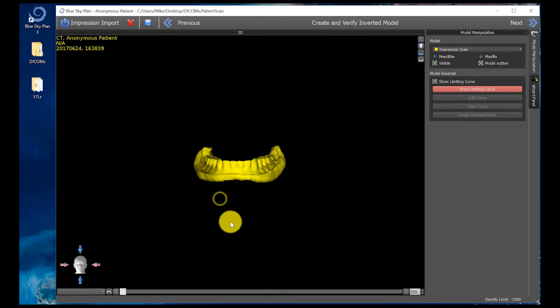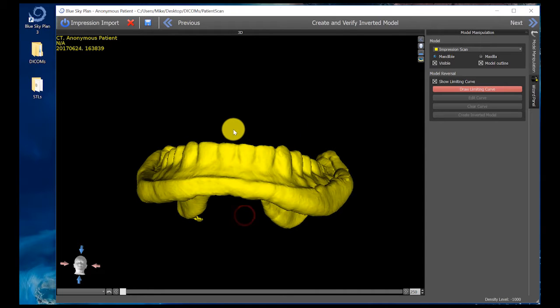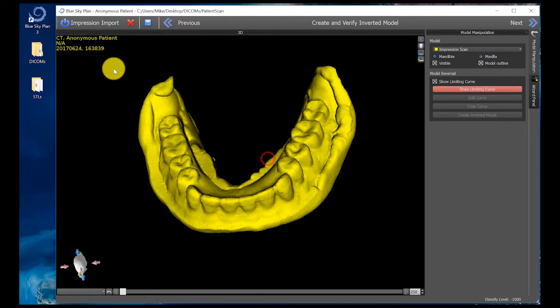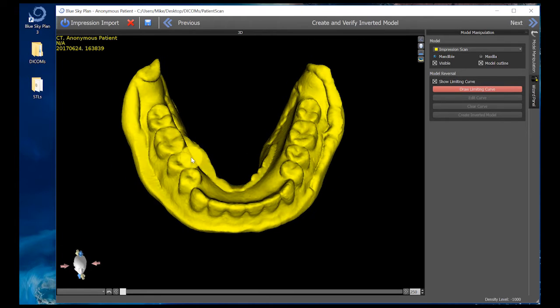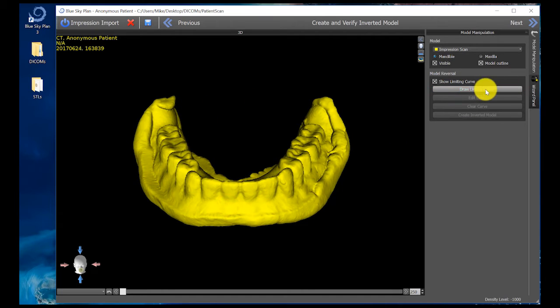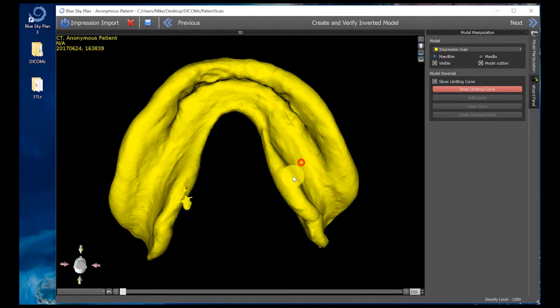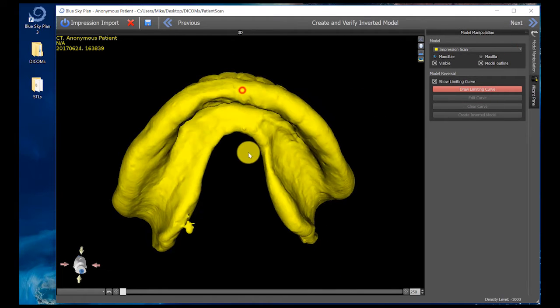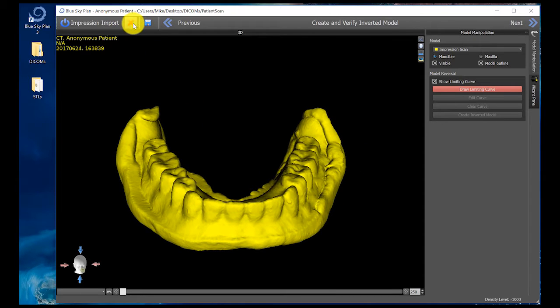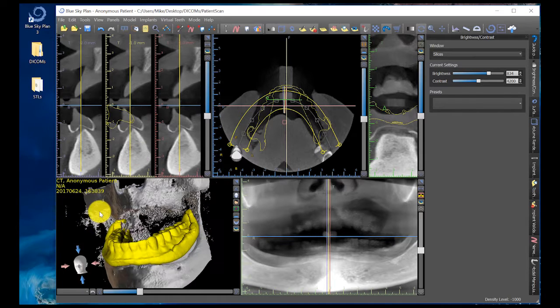Now that the computer has processed that information, it's going to show a three-dimensional rendering of the patient's cone beam scan data. This has successfully created a model that can be exported as an STL file. I want to stop the wizard right now — I don't want to draw the limiting curve unless I want to generate a model from my radio opaque PVS impression, which is a more advanced technique and unnecessary for our Lodi guides. I just click the red X button and it brings in my patient scan.